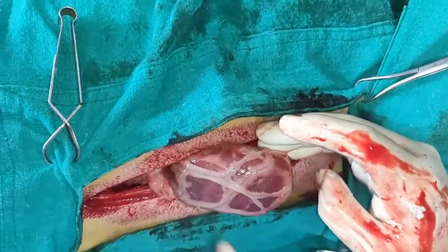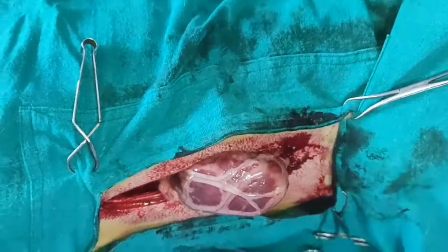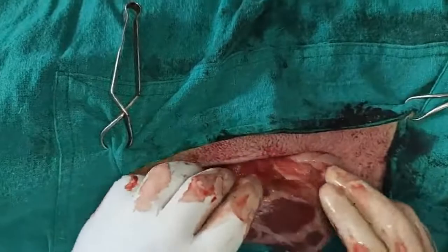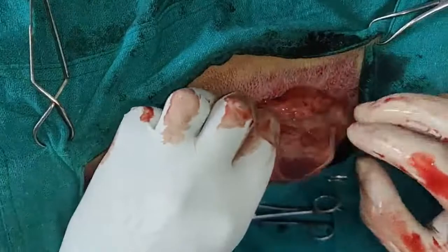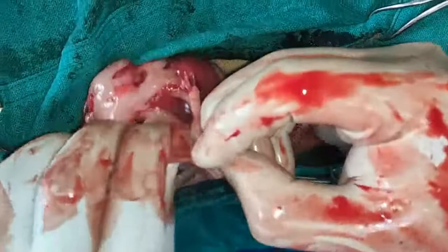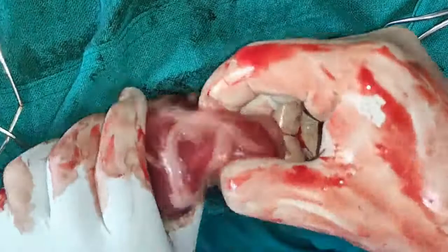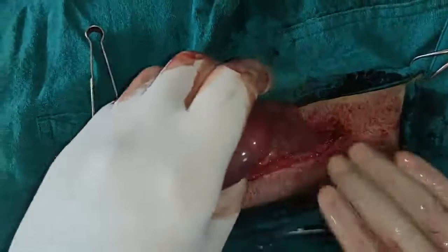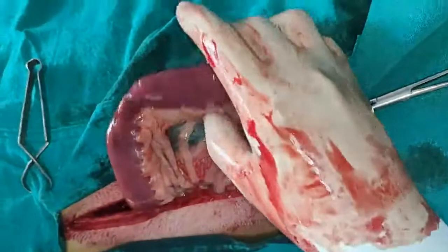Whenever there is an obstruction in the intestine or in the abdomen, the omentum is basically wrapped around it. So we can see here how nature wants to protect against any obstruction in the intestine. You can see here that the omentum is wrapped around this intestine. So what I diagnosed by the history is that this animal could have eaten a mango kernel. Now let's see whether it is a mango kernel or something else. That is why, even after doing intestinal surgery, we put the omentum, or omentalization.